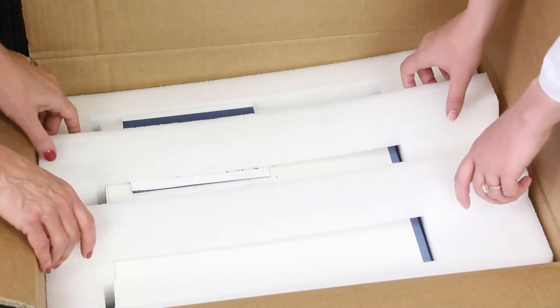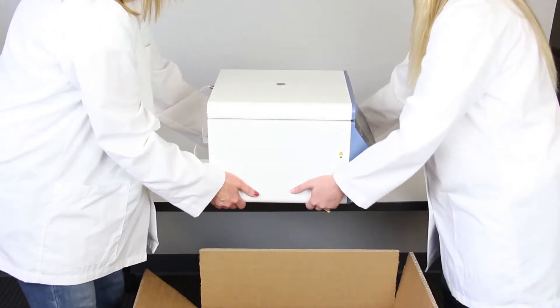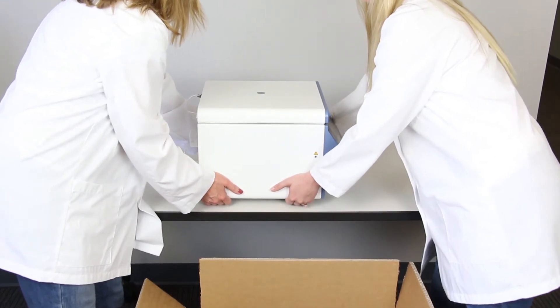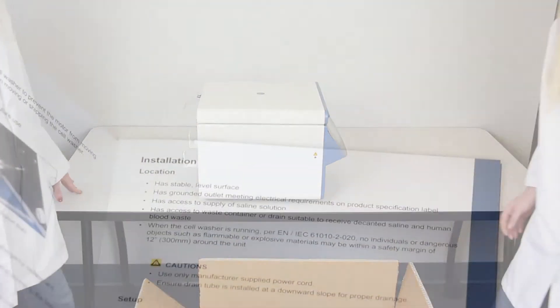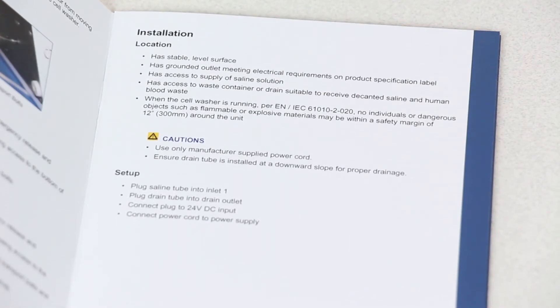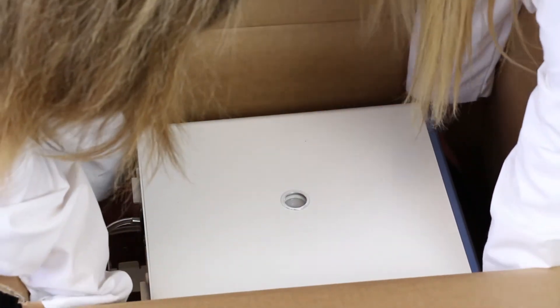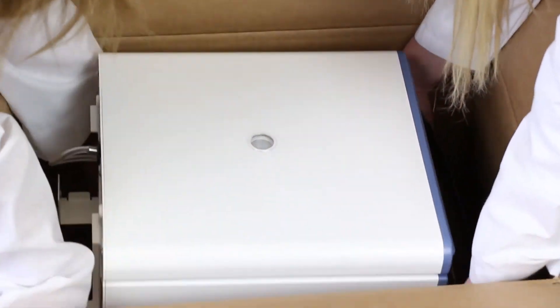First, we'll unpack the unit. Note that it comes with a bag of accessory items. When selecting a location for the Ultra CW2, be sure to set it on a sturdy table clear of other items. See the quick reference guide for specific location requirements. When lifting the Ultra CW2, we recommend that two people lift, one on each side.